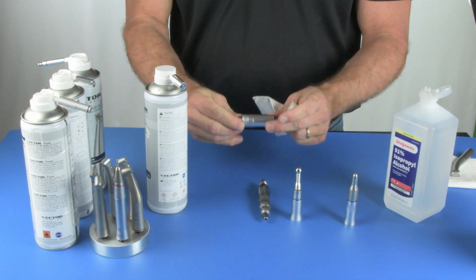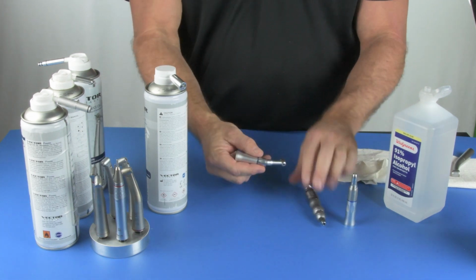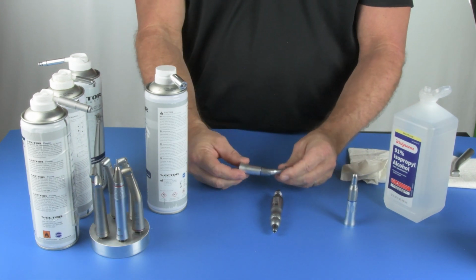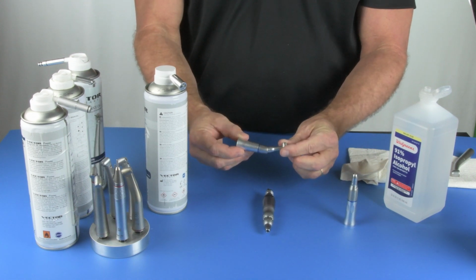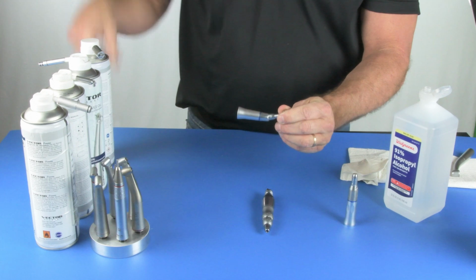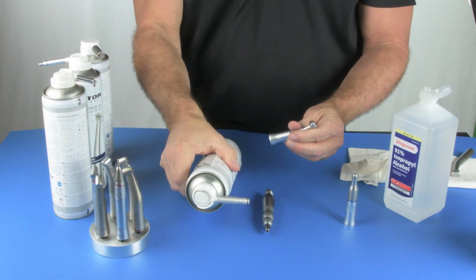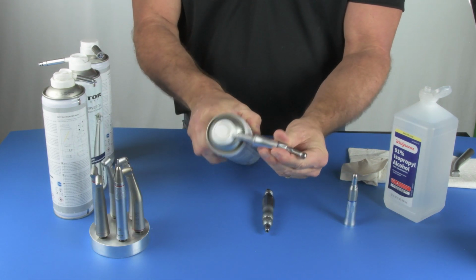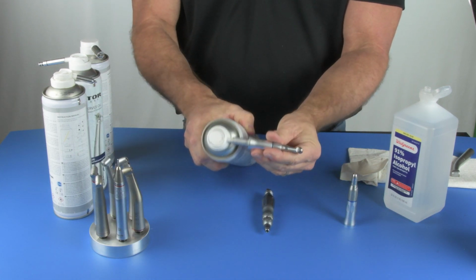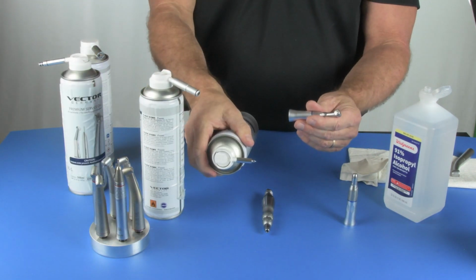The attachments are a little bit different, so we're going to go over each one. The contra-angle attachments on these handpieces are generally in 2 pieces. So it takes up to 2 different lubrication nozzles to lubricate these correctly. One of them is called an E-type nozzle, which is very common. It fits all the way up into the handpiece like so. You can't miss it. You'll know there's only one like that. And it also takes a pointed nozzle, which we'll get into in a moment.